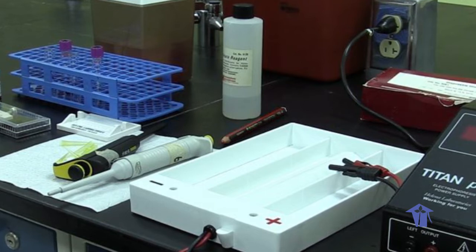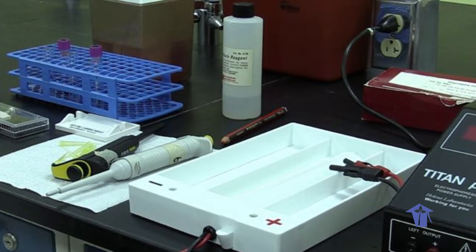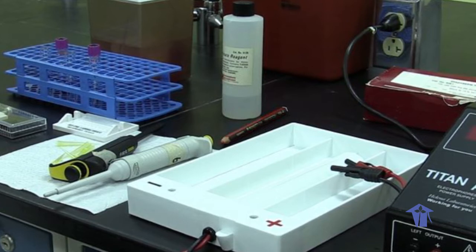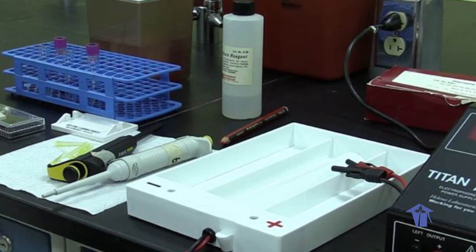But there are other methods of separating these hemoglobin variants, and they include acid agarose gel, isoelectric focusing, and high performance liquid chromatography. These are more expensive and they are not regularly used in most labs in Trinidad. The high performance liquid chromatography, or HPLC, is a very fast, sensitive, largely automated method which requires minute quantities of sample.